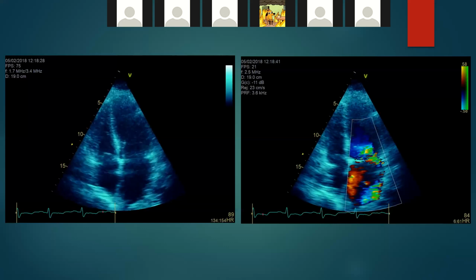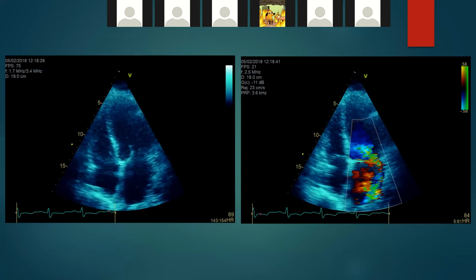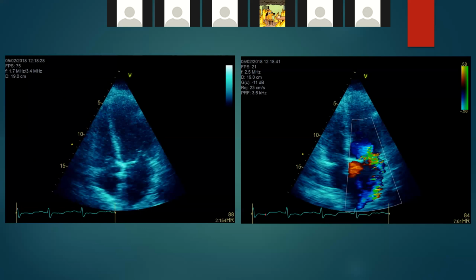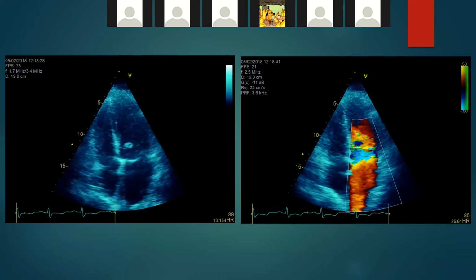The right, again with color flow Doppler of the apical 4, has a very aggressive Nyquist, which is perfectly acceptable at 58. You've got an eccentric Coanda effect MR jet into the left atrium. Again, that's more posteriorly directed.